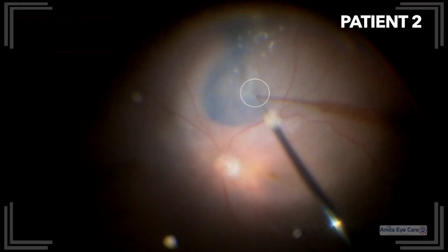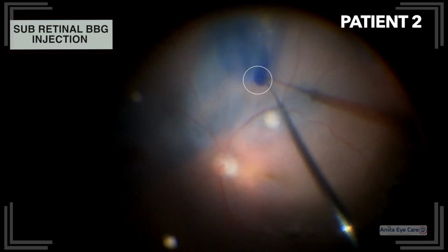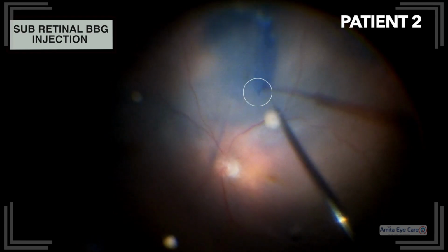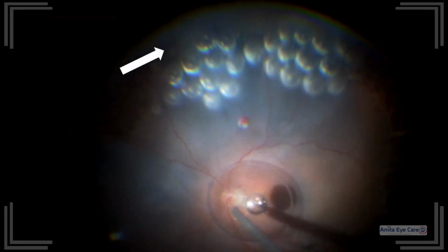We use this same technique in another patient where we inject BBG dye in the subretinal space to visualize the occult break. We should make sure that there is no air in the injector or there will be an inadvertent injection of air bubbles in the subretinal space, as you see here.